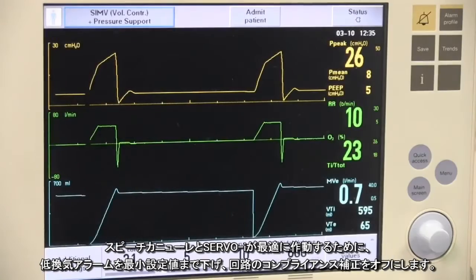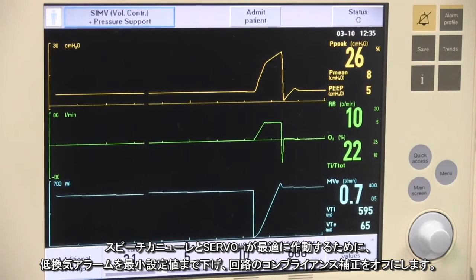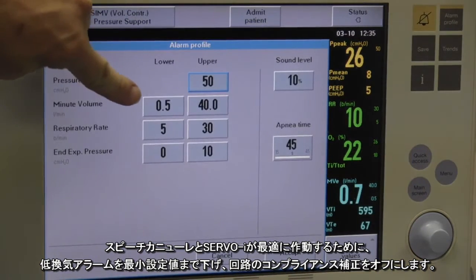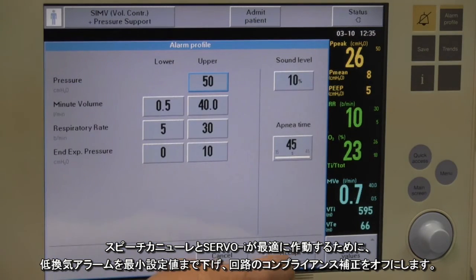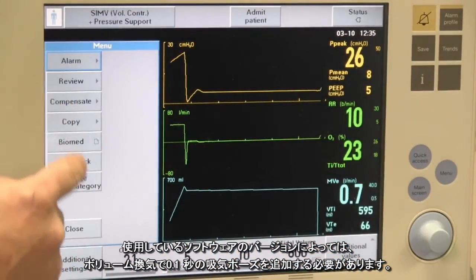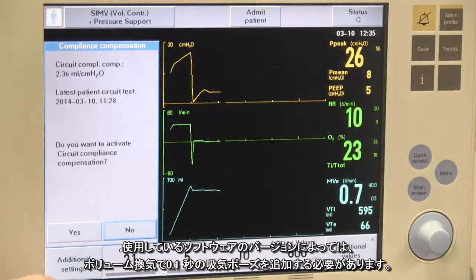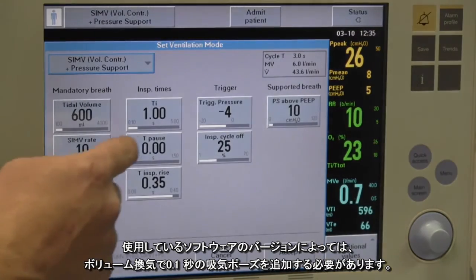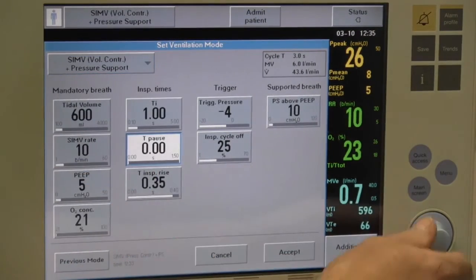In order for the speech cannula to best interface with the Servo-i, turn the low minute volume alarm down to its lowest active setting of 0.5. Turn your circuit compliance compensation off. Depending upon the software version being used, it may also be necessary to add an inspiratory pause, or T-pause, of 0.1 second in volume ventilation.